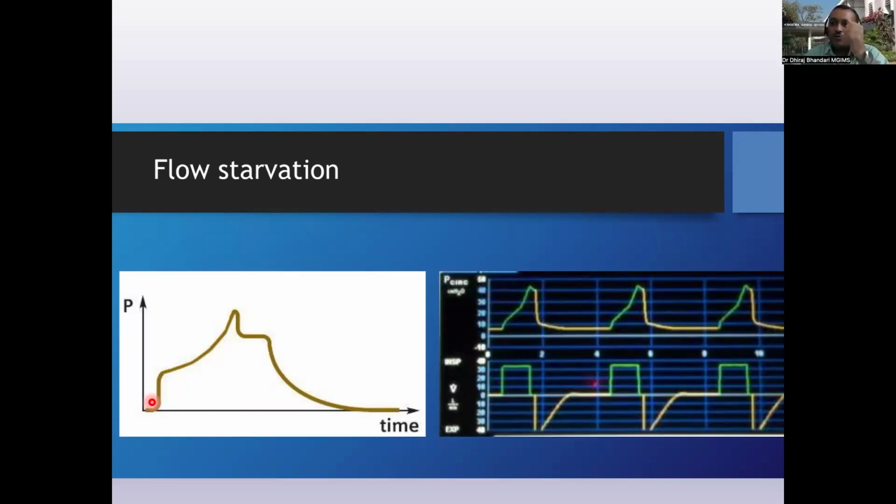What we do is, the moment we put a tube, we keep our normal setting for this patient, something like what we do in a normal ASA 1 patient.